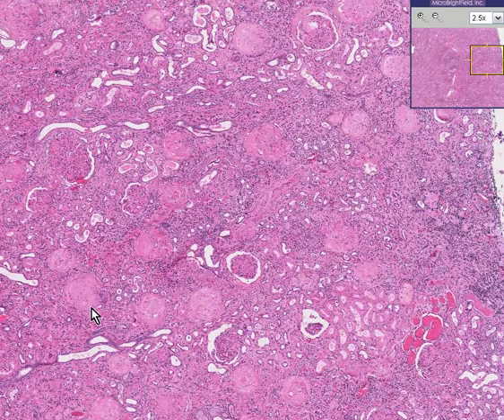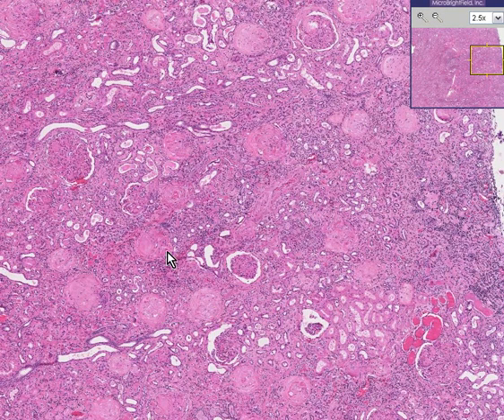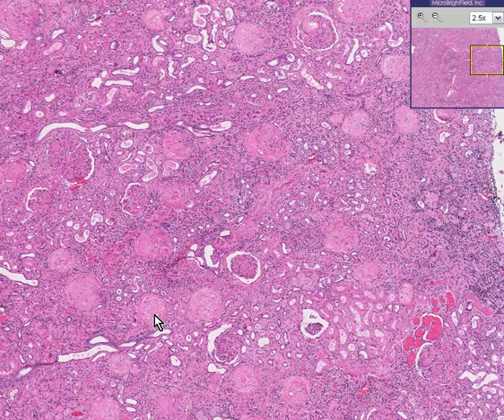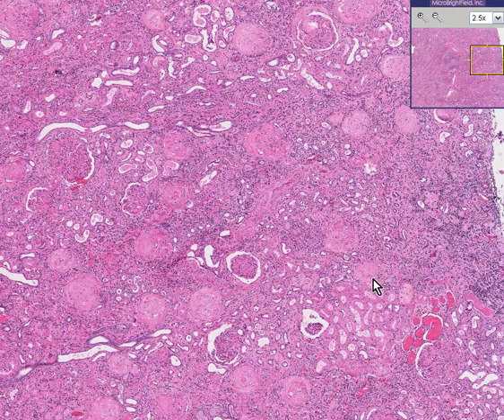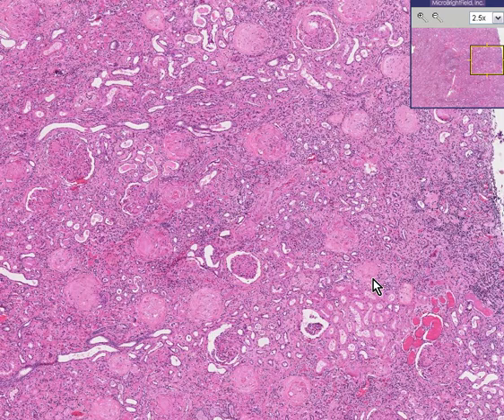However, there are probably a lot more glomeruli that don't seem to have much texture to them at all. They appear to be fibrosed, hyalineized, or sclerosed. There are more sclerosed glomeruli in this kidney than there are normal ones. This is diabetic glomerulosclerosis.